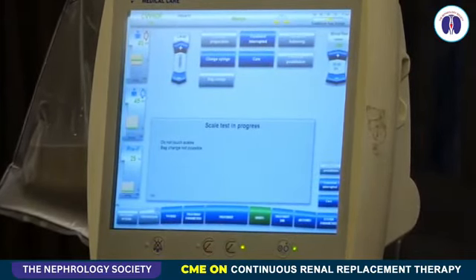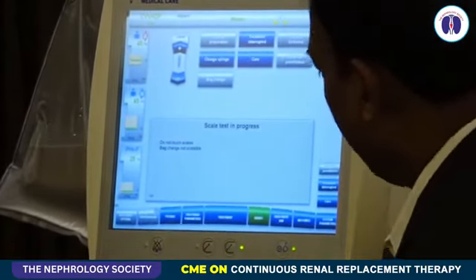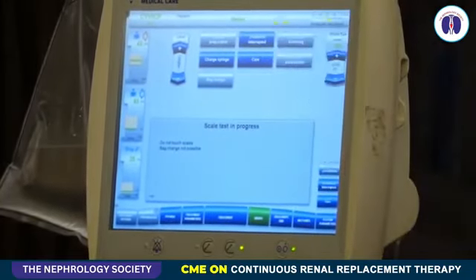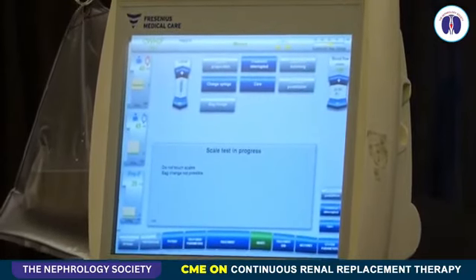So it is somewhere around 18.5 plus GST. We just require a 16 ampere power plug, and you can start. The cost is negligible.